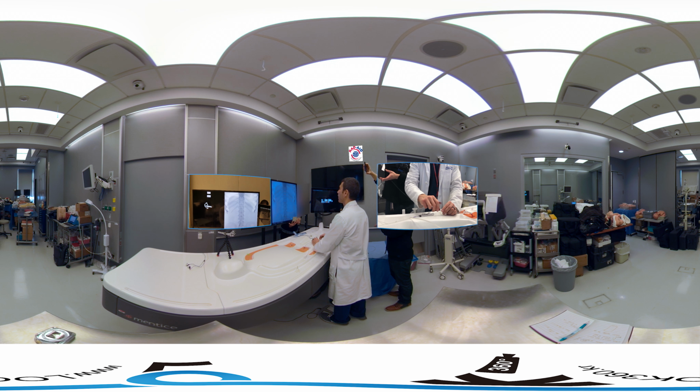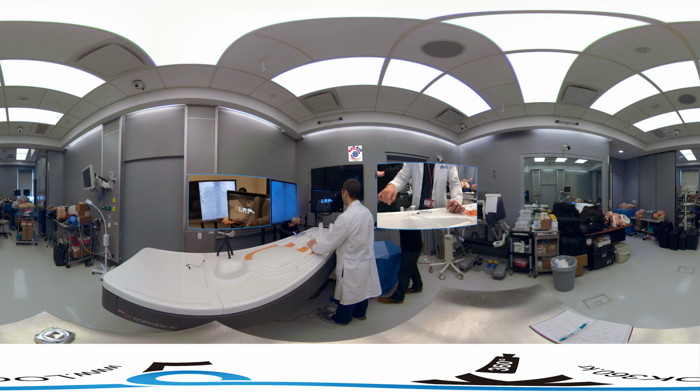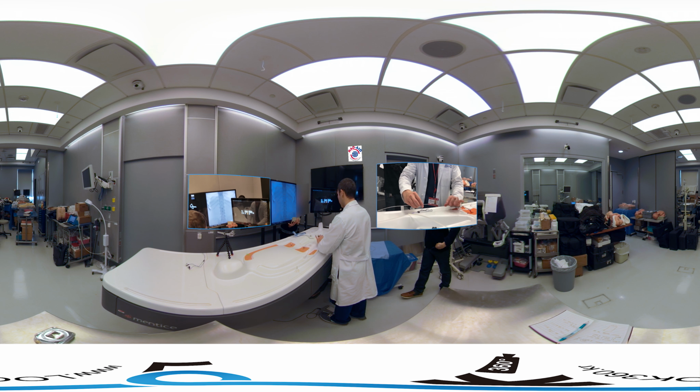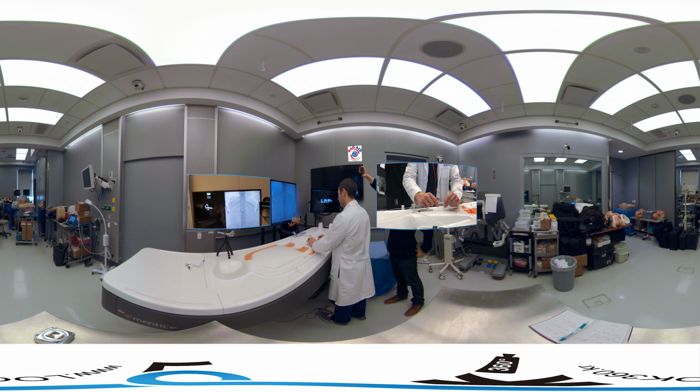And we'll get it back up to the level where we want to leave the filter, which is around L2. Remove the wire now that we know we're in a safe location. And we'll go back to loading our filter.